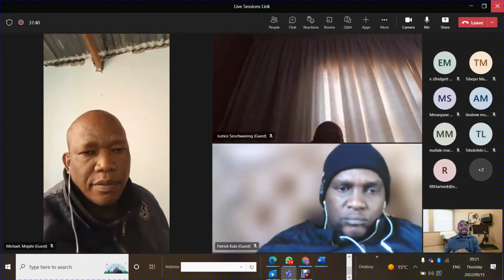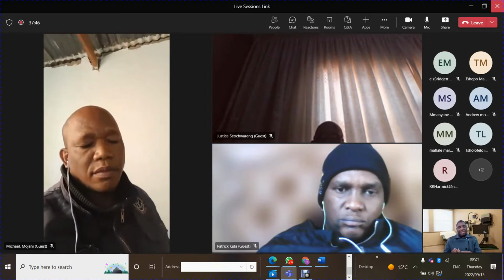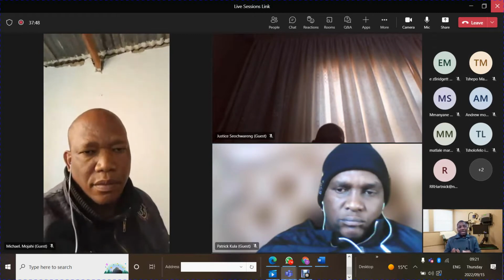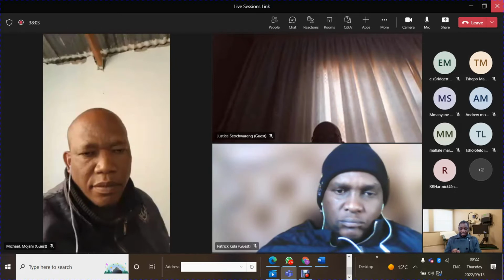The more scarlet it is, the more oxygen you have in that blood. If there's poor oxygen in the blood, it means you have more blue blood than red blood. And the more of it you have as light transmits, it's picked up on the other side. And then the redness, as you know, we have that.